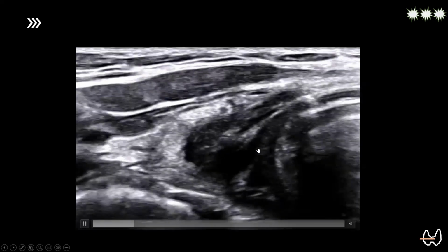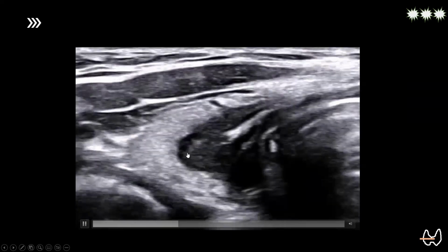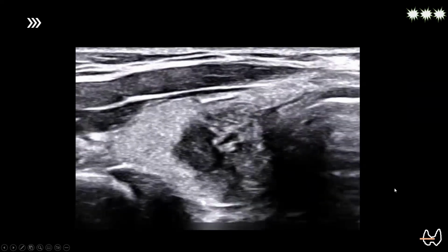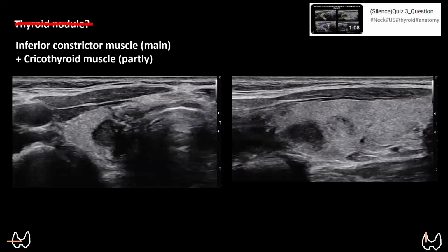I'm going to show you a clip of the cricothyroid muscle meeting the inferior constrictor muscle a little bit lower. This person has prominent muscles here, which can accidentally be mistaken for a thyroid nodule.